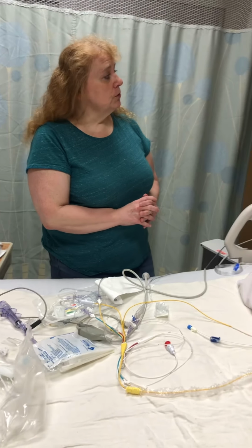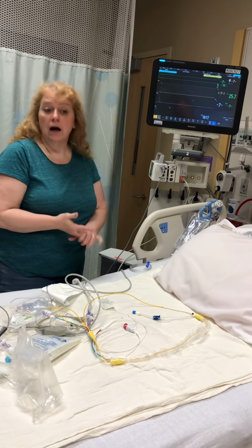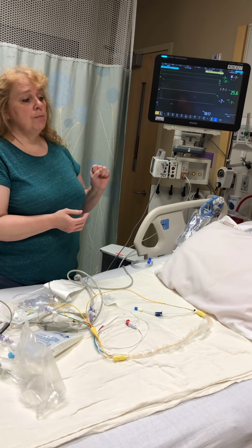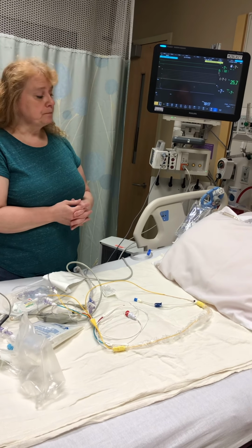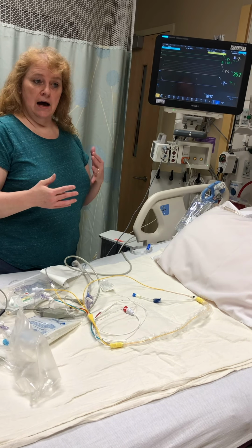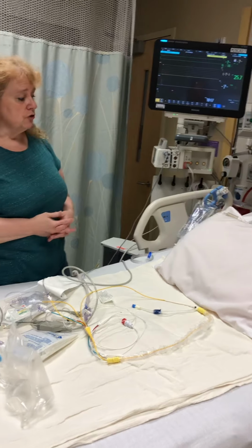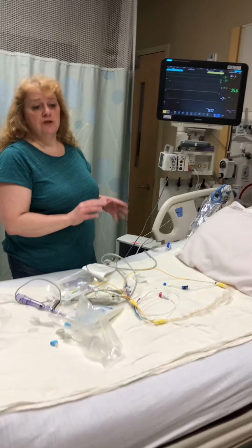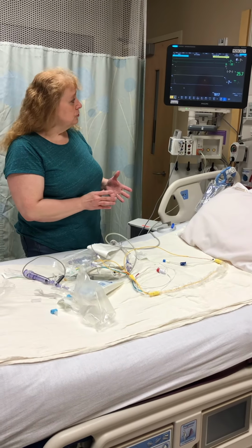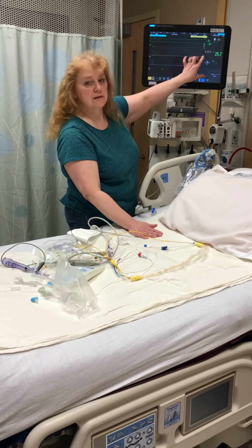But what you do is, in a vented patient, think vented valley, ideally your PA numbers will be lower, based on the pressures within the chest with inspiration and expiration. In a non-vented patient, it'll be higher. Another way you can do it is just put your hand on the patient's chest and watch as it goes past the monitor.